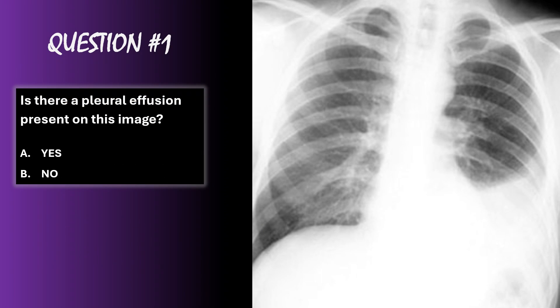Let's go through a few cases to see if any of this stuck. Is there a pleural effusion present on this image? Yes — there is a pleural effusion in the left lower lung field with blunting of the costophrenic angle and meniscus sign.